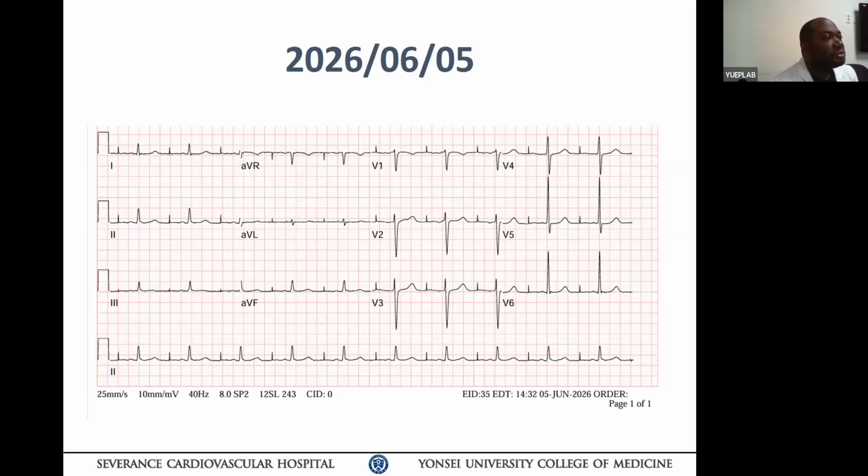Because if you look at the echo Doppler, the right atrium and left atrium contraction are completely separate. The filling defect and low function and so on is most important. So we created a lot of mess before. I think this is another issue that we face.